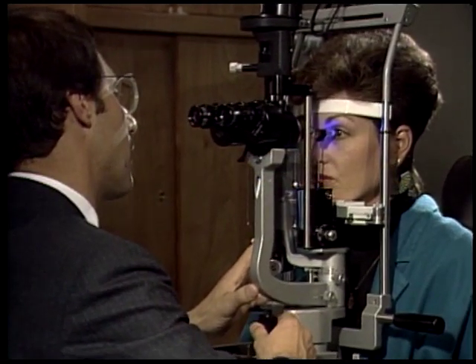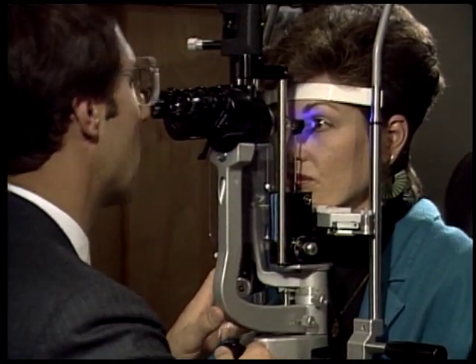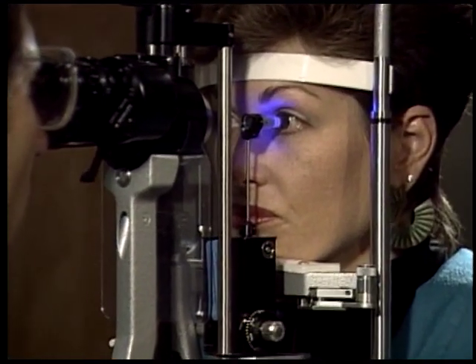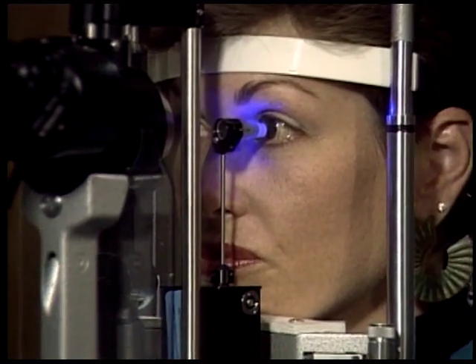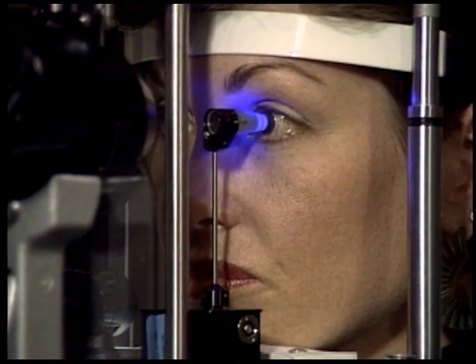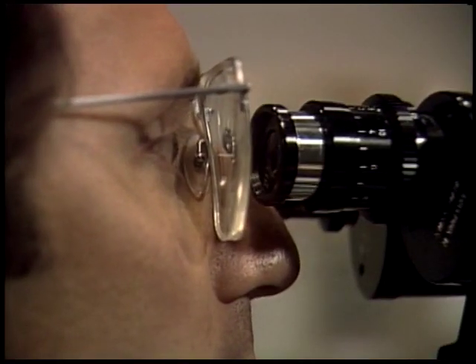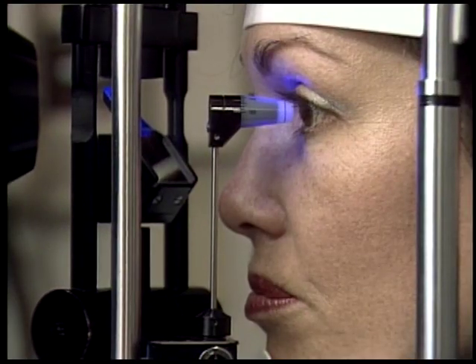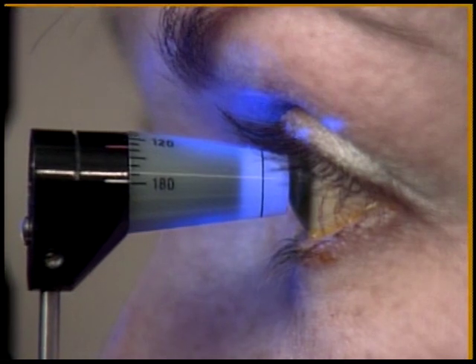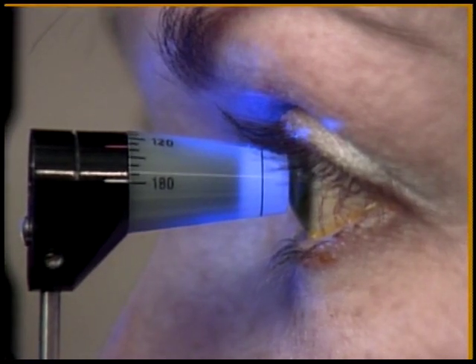A fundamental component of every eye examination is a determination of intraocular pressure. This assessment provides information on the ordinary function of the eye and assists in the detection of glaucoma. Once you understand the principles, the mechanics of checking intraocular pressure are straightforward. In this videotape, we will review how to measure intraocular pressure by Goldmann Applanation Tonometry.